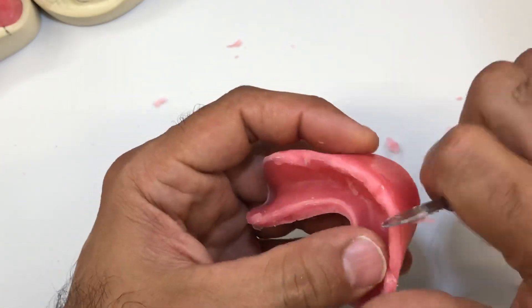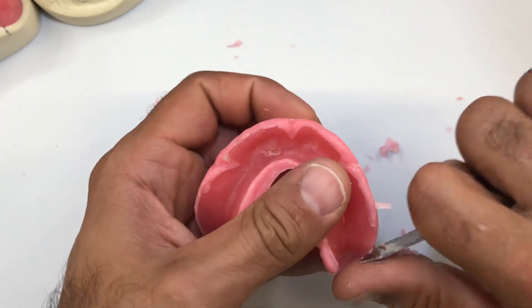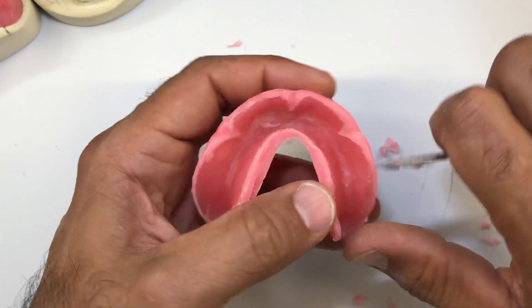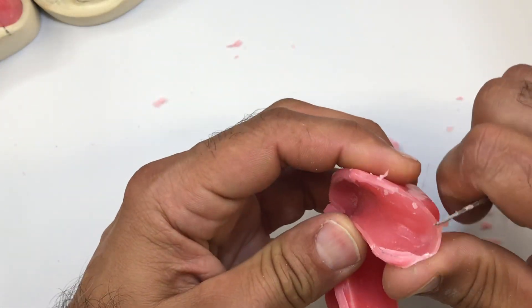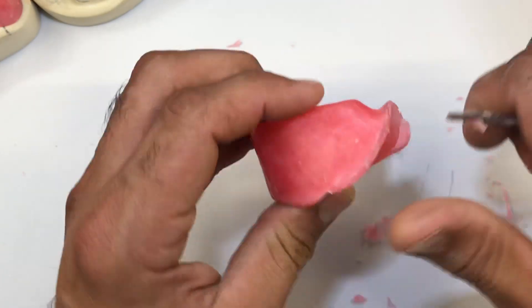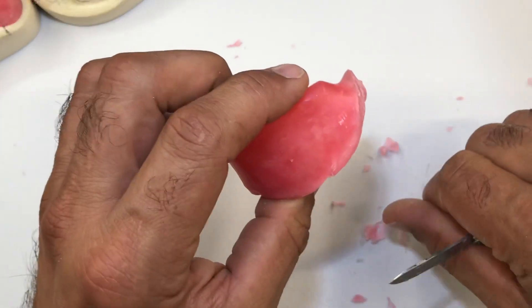Clean up the frenal attachments, and utilize my ruler to measure 18 millimeters above the labial frenum. We didn't have any wax back here, but some of it just worked its way there, so we're going to scrape that away.